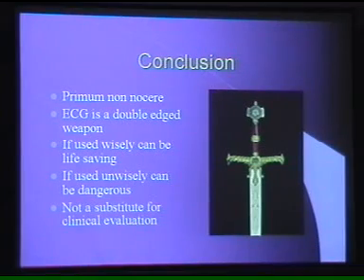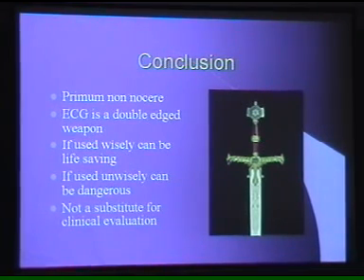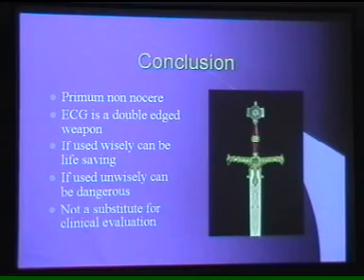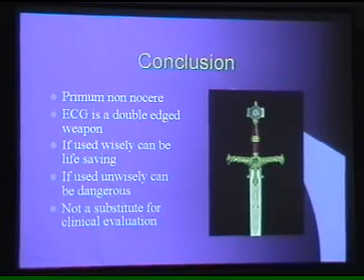It must be correlated with the history and the other physical findings if one is to avoid the pitfalls. But it still remains that ECG is one of the investigations which should be available in most situations in general practice, because even with very little experience, one can pick up very useful and important information which may suggest further need for evaluation.